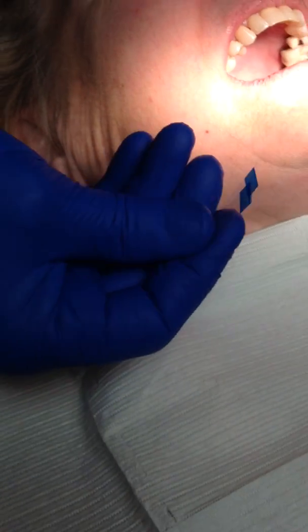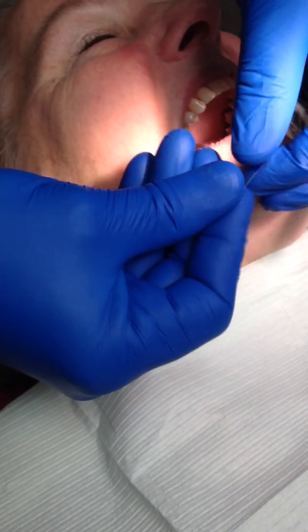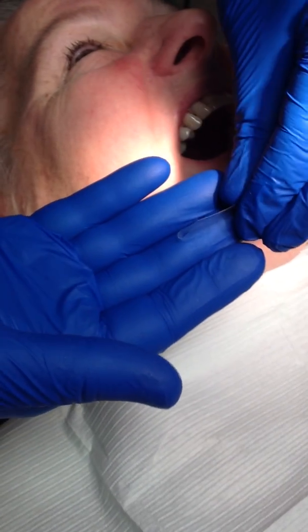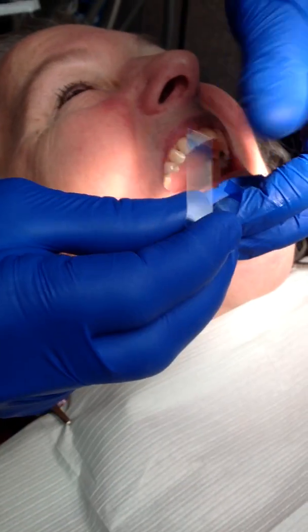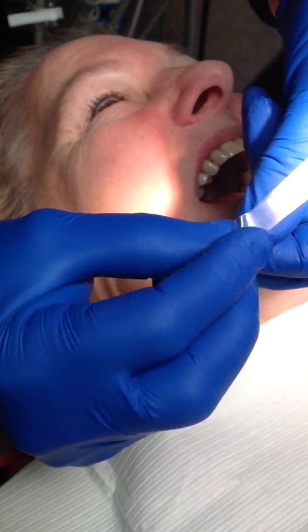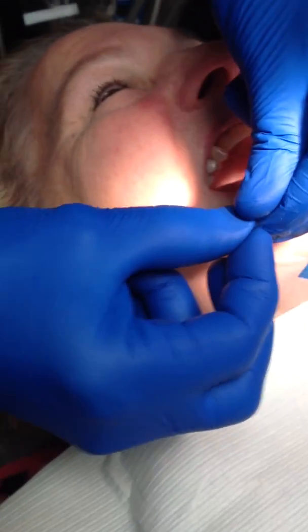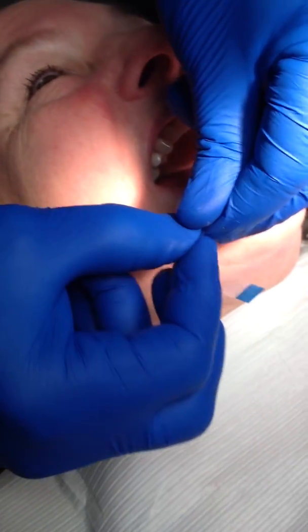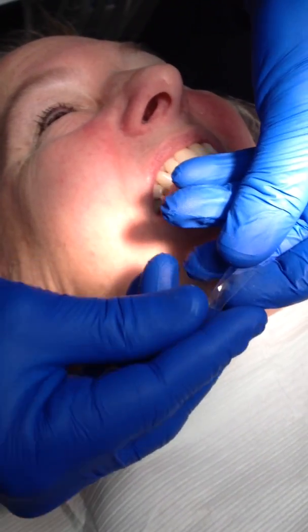What we do next is we go ahead and take the contour strip, we fold it in half. We take the bent area and we go back and forth with it, so it creates kind of a little bend in the band. We'll then fold these little corners over. And these little corners, once they get folded in, fit around the tooth but they actually fold in.